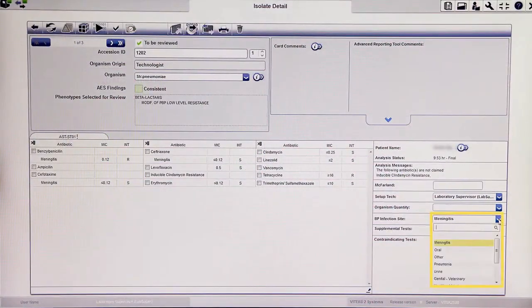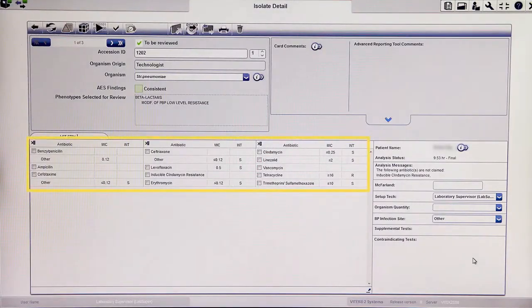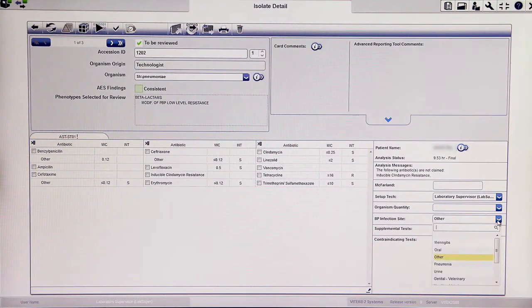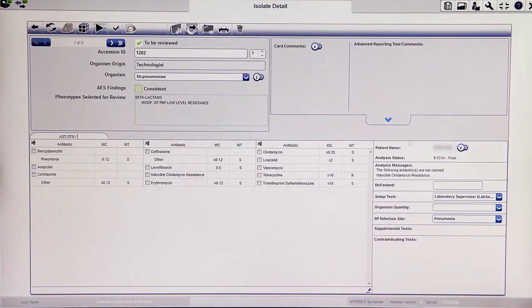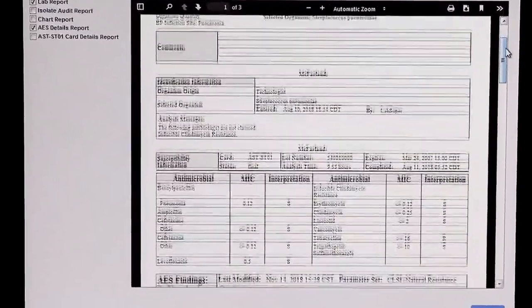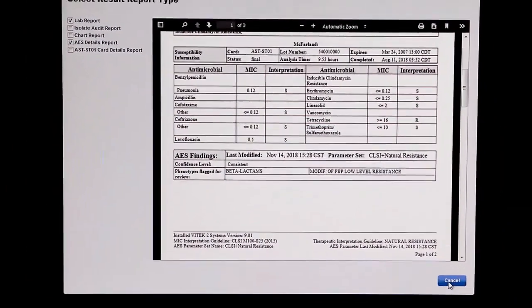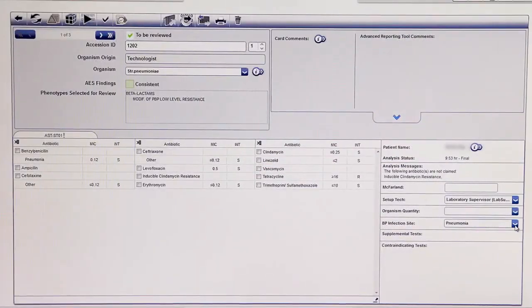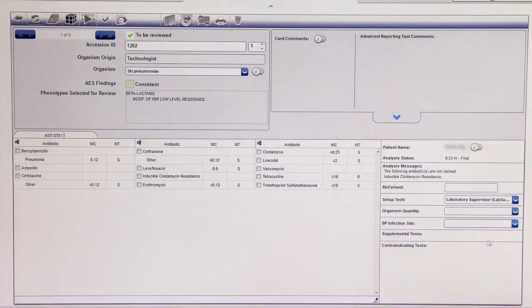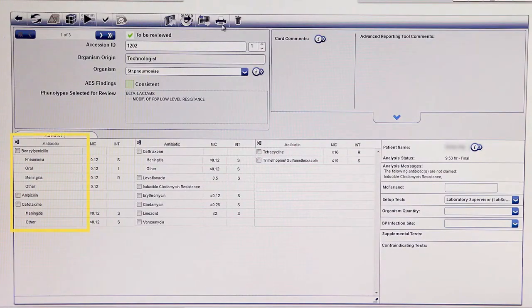If an infection site is selected for which there are no defined breakpoints in AES for the active parameter set, then antibiotics with an infection site of Other are displayed in the isolate detail view. If an infection site is not selected, then all possible infection sites will be displayed based on the active AES parameter set.